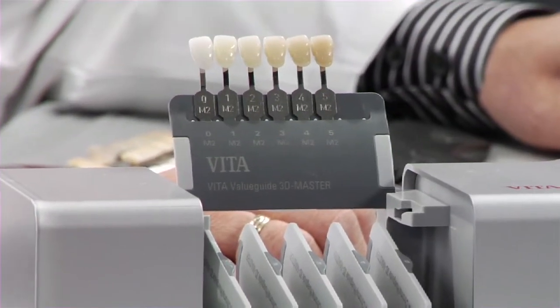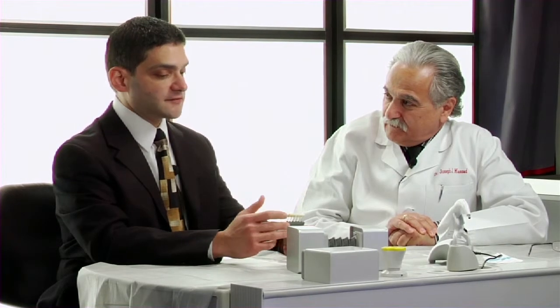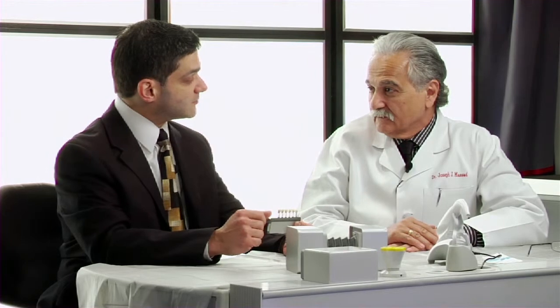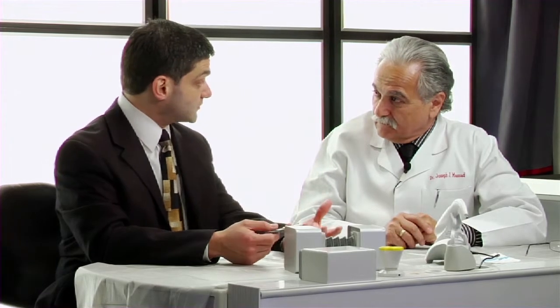Thank you very much. These are two very exciting advancements that debuted this past October at the American Dental Association show in San Antonio. The first is the Linear Guide 3D Master. As you know, 3D Master has been out for about 10 years. The Vita company has developed the only evidence-based shade guide on the market — actually based on what we know about the colors of the human dentition — and has now made it even simpler to use, allowing you to get a scientific, objective shade quickly and accurately in two very quick steps.